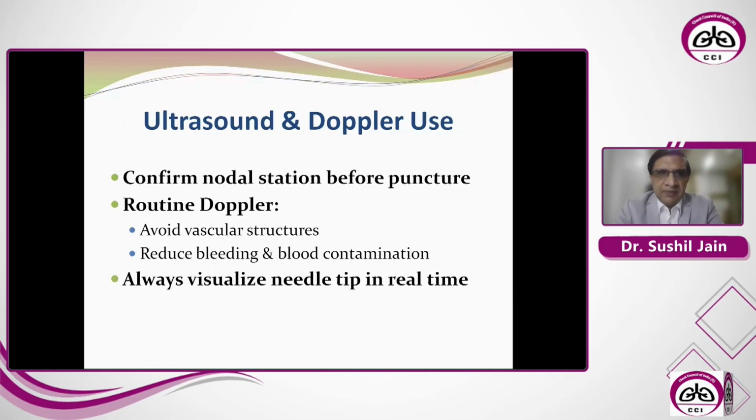Then comes ultrasound and Doppler use. Confirm nodal stations before puncturing, and use Doppler routinely to avoid vascular structures, reduce bleeding, and blood contamination. Always visualize the needle tip in real time. Make sure you are able to see your needle tip in real time while doing the procedure.